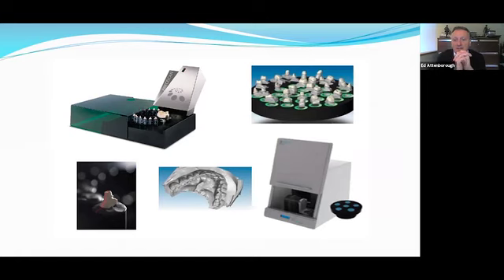Now, laser technology has certain advantages in that the laser beam has an infinite depth of field because the sides of the beam are parallel. So the laser is in focus at 0 and at infinity. And that's quite useful because it means that the accuracy of the scanning isn't related to the depth of field. And that's important, as we'll come on to find out about. So optical scanning is the common technology that's used in all intraoral scanners, and it comes from desktop scanners.